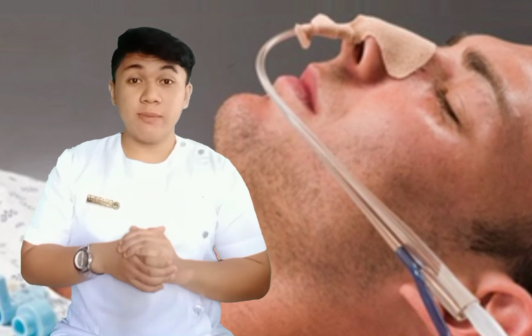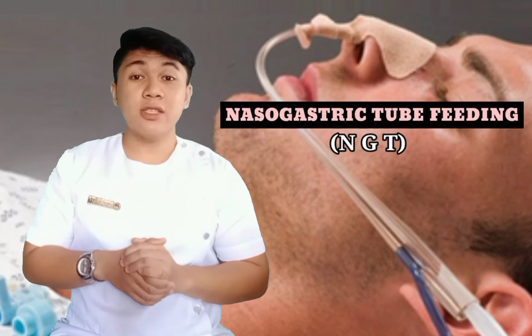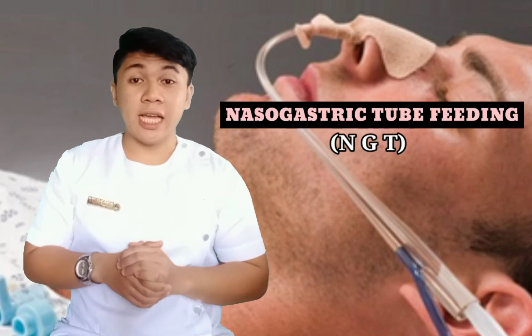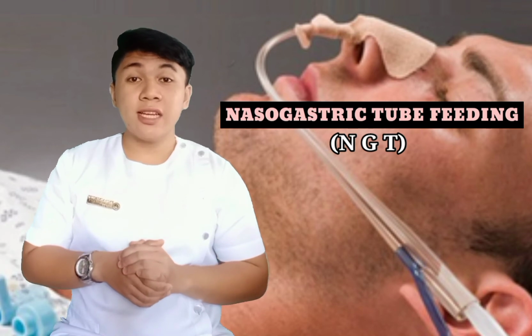For this video, I will perform nasogastric tube feeding or NGT. But first, what is nasogastric tube feeding or NGT? Nasogastric tube feeding is the installation of specially prepared nutrients into the stomach through a nasogastric tube.